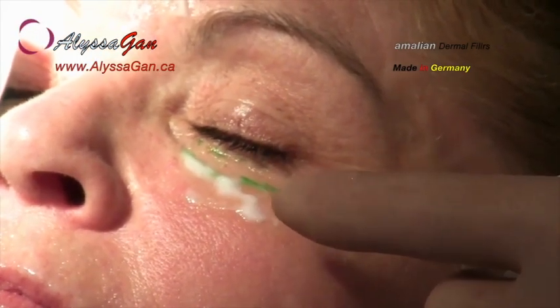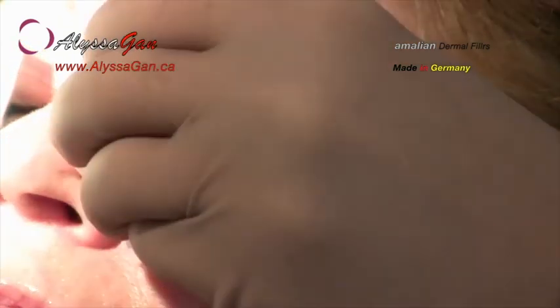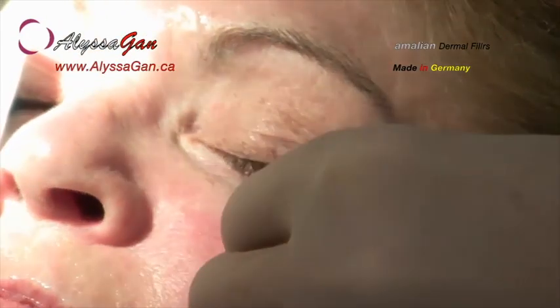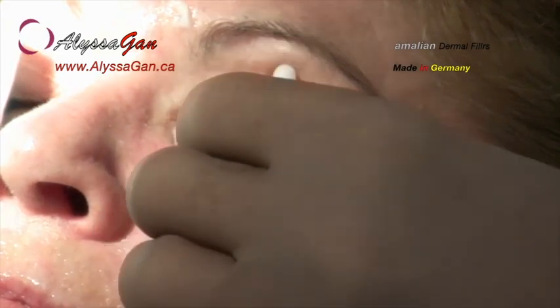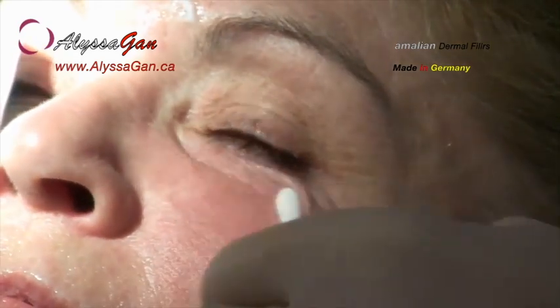Now we turn to the other side and also see the applied anesthetic ointment with 20% lidocaine. The ointment is removed and the area is disinfected with alcohol. Thorough disinfection of this area is crucial, since the intervention would be rendered unsterile if the needle were to touch untreated areas of the skin.